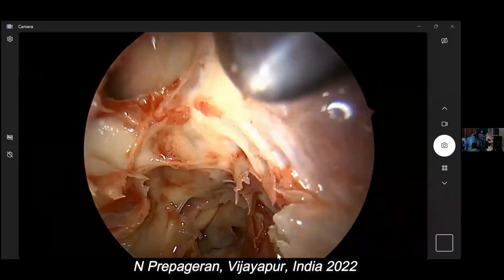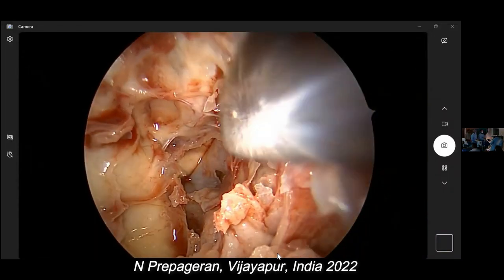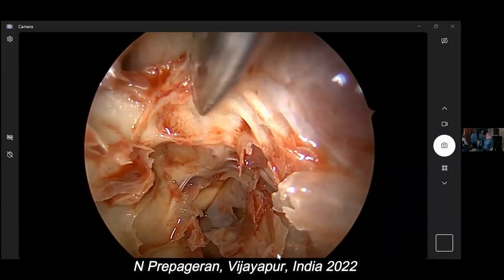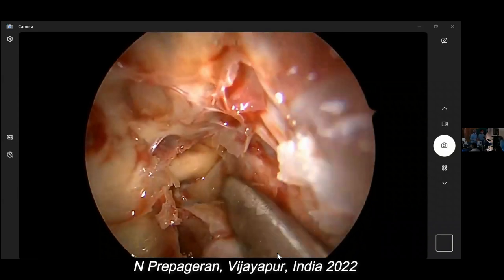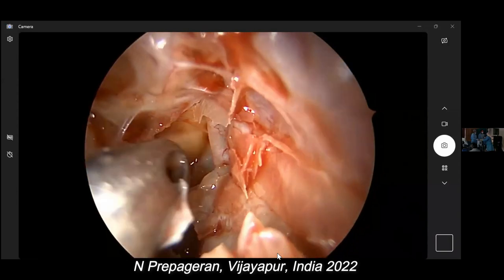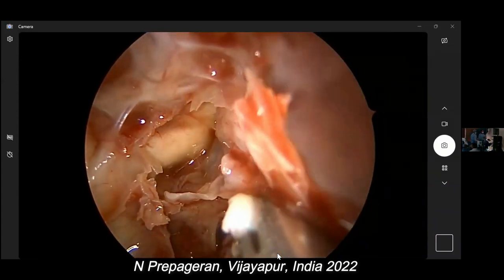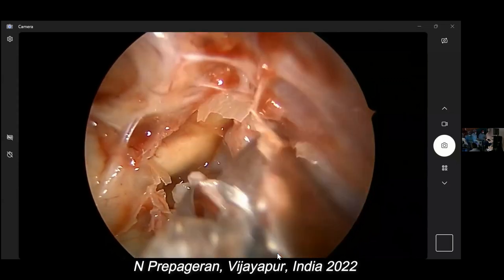All this is with a 0-degree scope. This is the posterior ethmoidal artery here, near the nerve. This might be the middle. So anterior, middle, posterior. Oh, Onodi cell. That's an Onodi cell. Yes, sir. Is your IGS working, guys? So if the IGS doesn't work, you use the IGS in your head that you're born with. Okay?